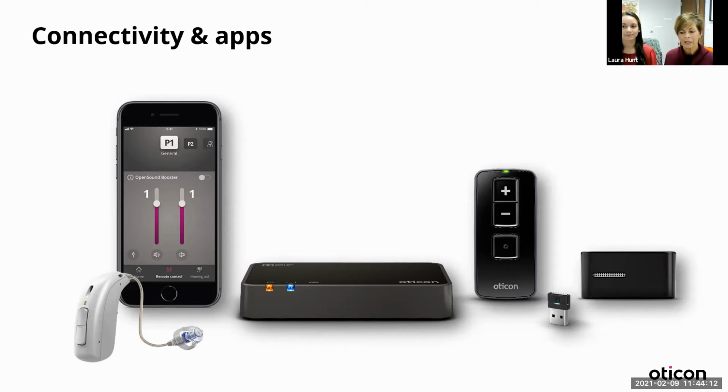So iPhone connectivity, being able to take a phone call right into your hearing aids, eliminates that background noise. And it is something that I can't tell you. I have patients who are on the verge of having a cochlear implant because they can't hear on the phone. And now that they have this ability, they have now been giving out their cell phone numbers instead of the landline. So I really want to encourage a lot of you who are struggling on the phone, you're struggling with your Zoom calls. There are ways now to use your phone and your tablet in order to get that connectivity.